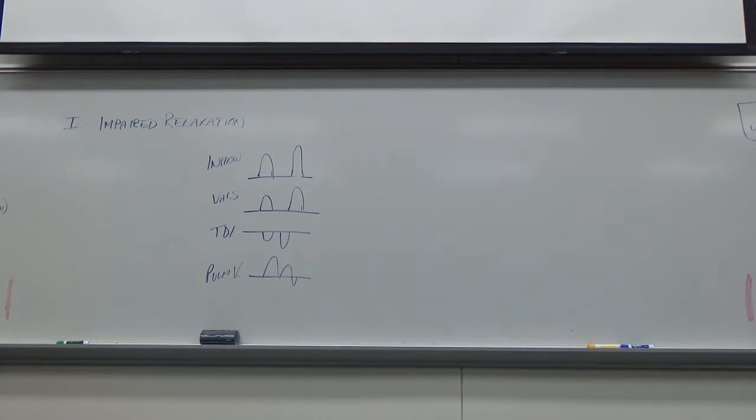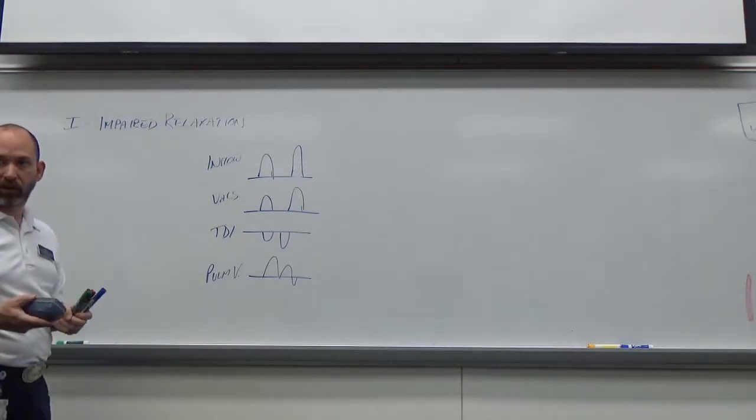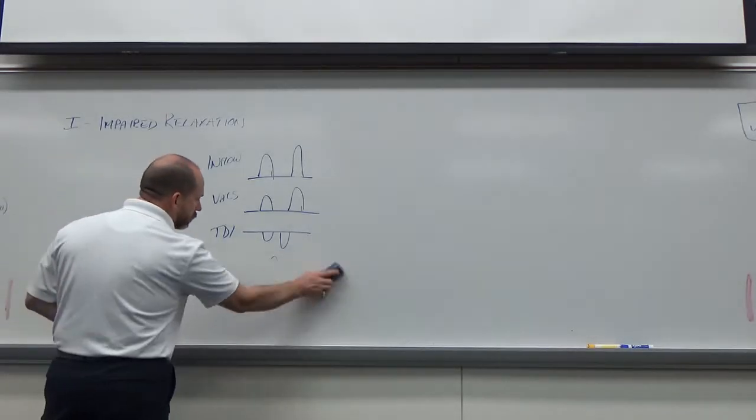In a real world situation, some of my numbers may be borderline, and some may suggest it's normal, some may suggest it's impaired. If 3 of them show me abnormal and 1 shows me normal, I'm going to call it abnormal. If 3 of them show me normal and 1 shows me abnormal, I might question the measurement I did. So you just use all of your information that way. The more pieces of information that's supported, the more likely that is the case.